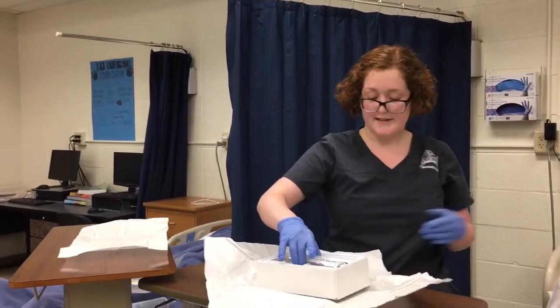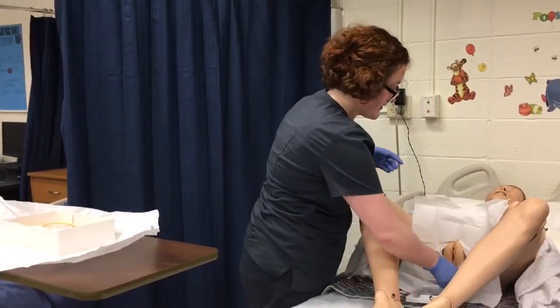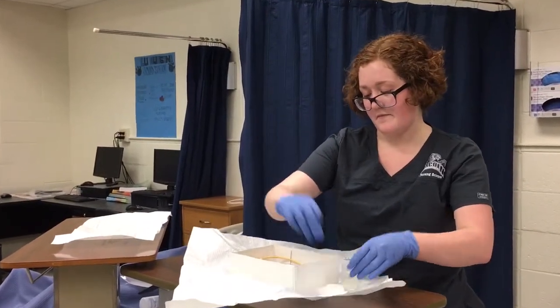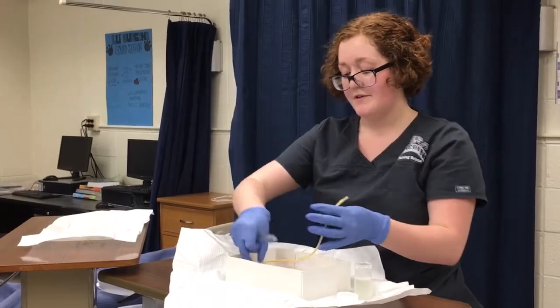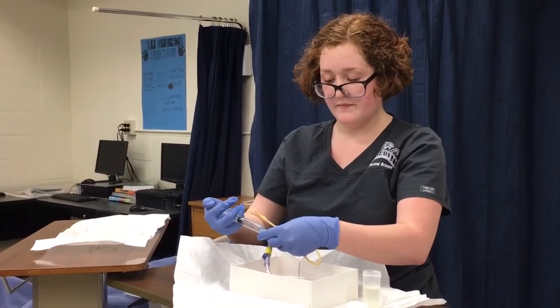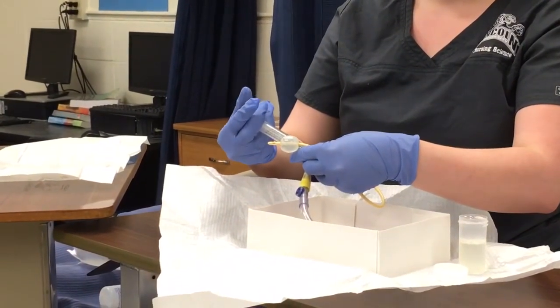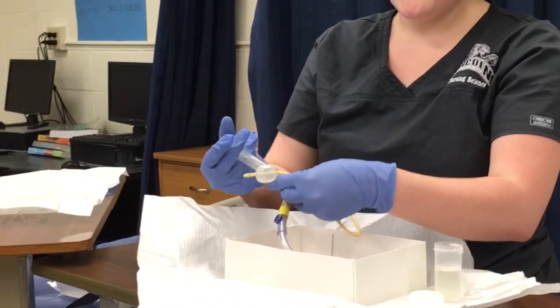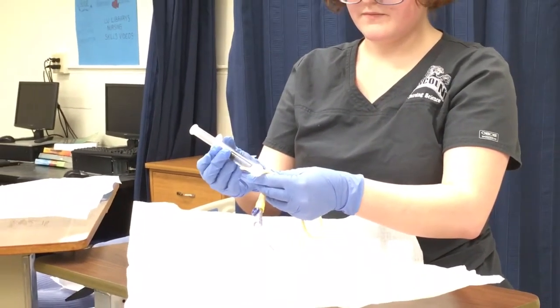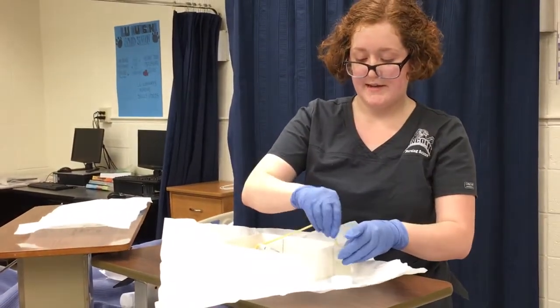I'm going to take my kit and place it on the patient's bed. I've already opened the swab sticks and set them down here. Now I'm going to come back over, open my lubricant, and then test out the catheter using a syringe filled with 10 milliliters of fluid. It seems to be going well. Now I'm just going to let it passively come back out into the syringe. I'm going to set that down in the lubricant.